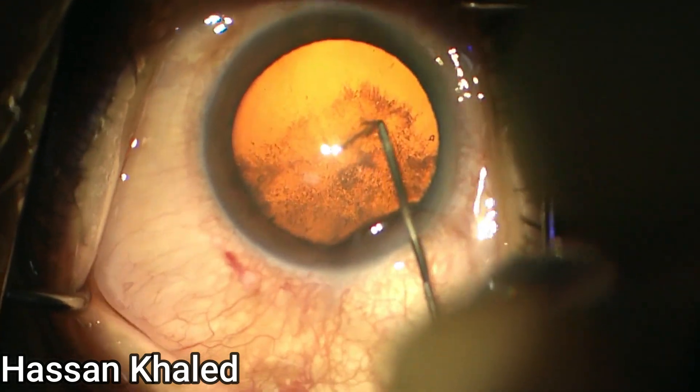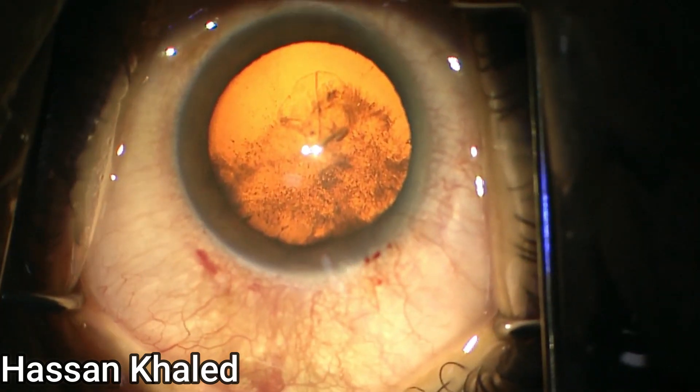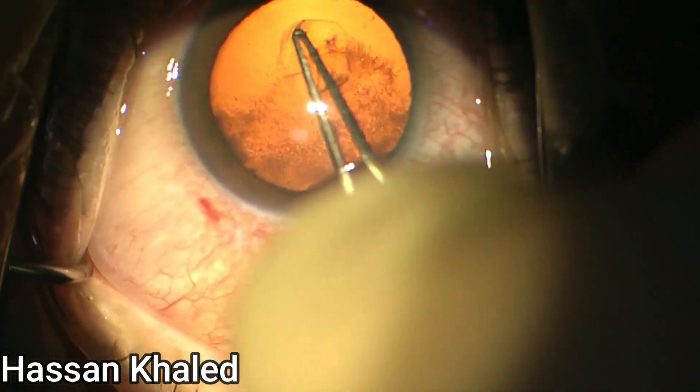I started with a 2.2mm clear corneal incision, then injecting dispersive OVD to coat the endothelium of the cornea.